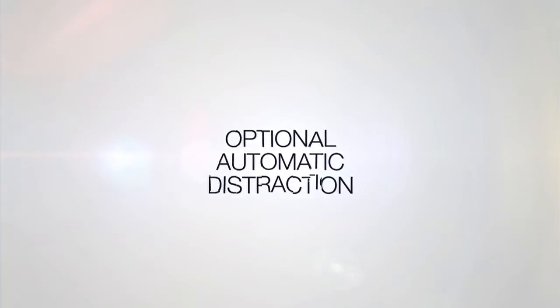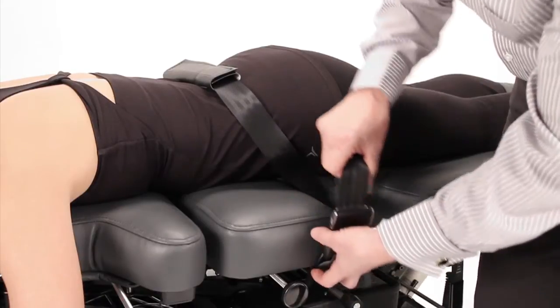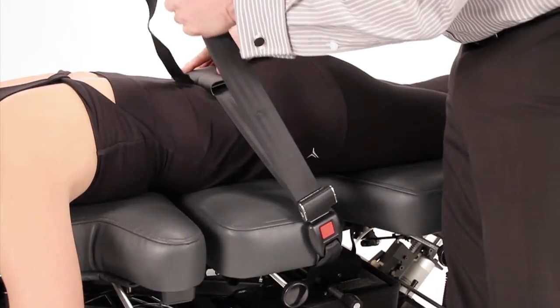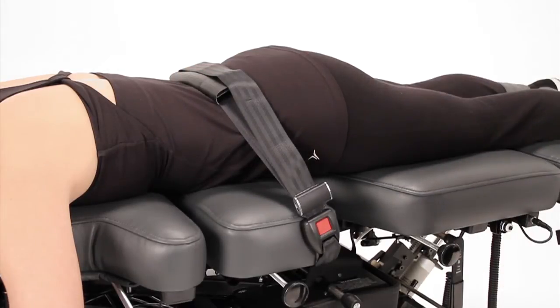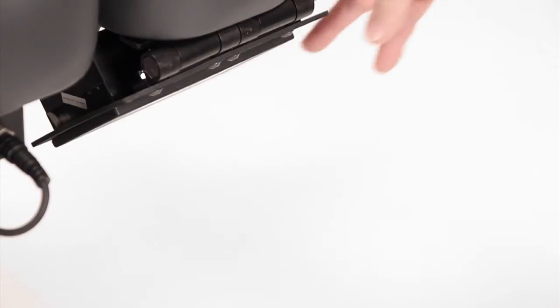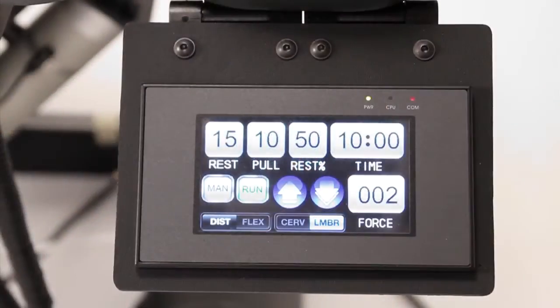Adding the option of auto distraction turns your Air-Flex into an effective traction table. Use the provided seat belt to help stabilize the lower back of your patient. Use the touchscreen to control your automatic traction settings. The rest setting controls the seconds that the patient will be in a rest cycle. The pull setting controls the seconds that the patient will be in the pull cycle.